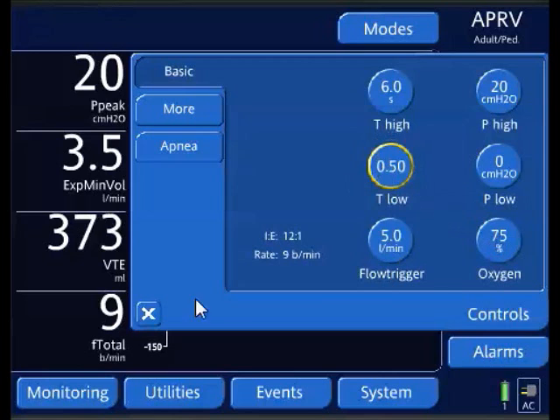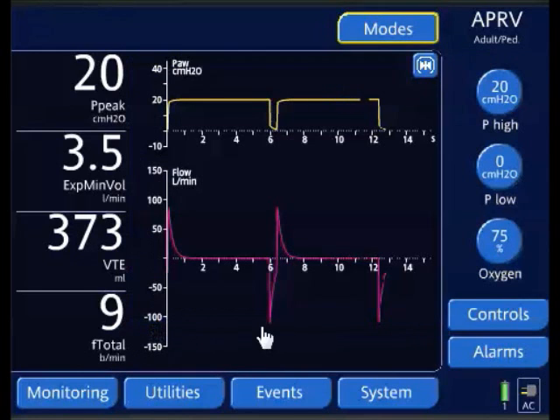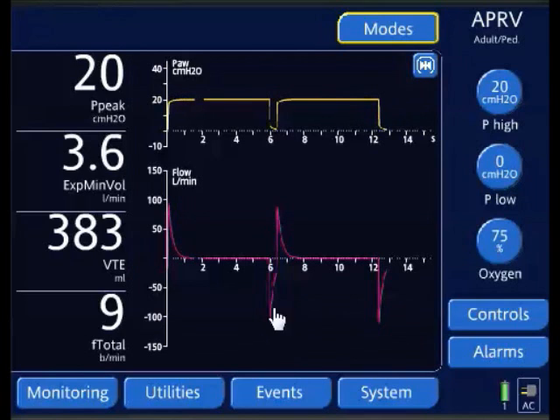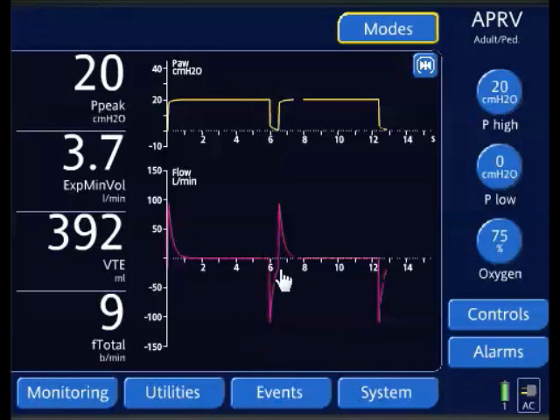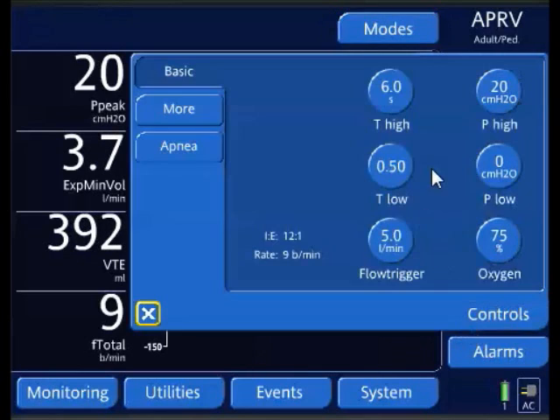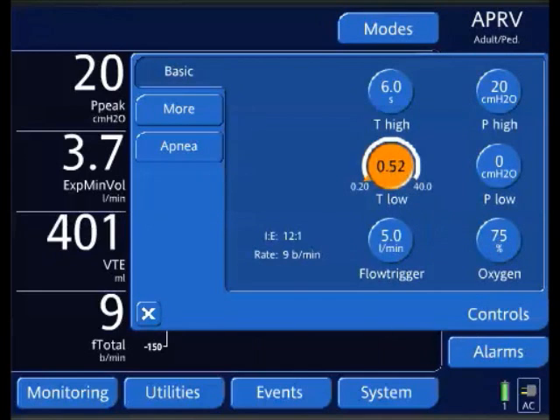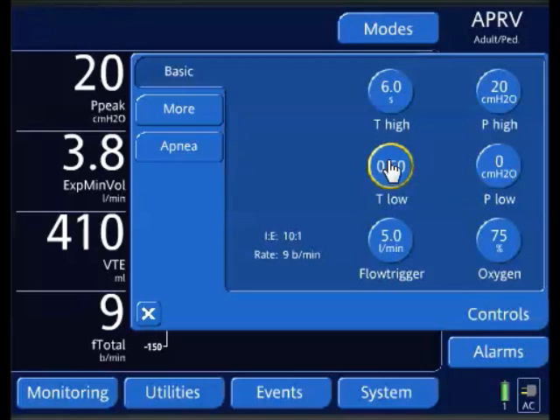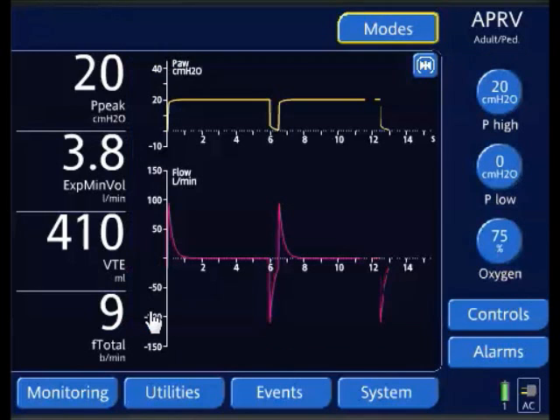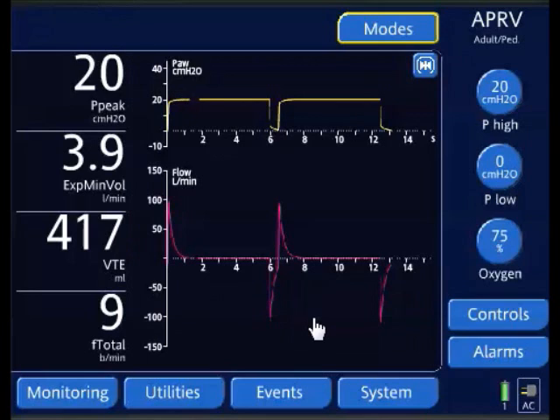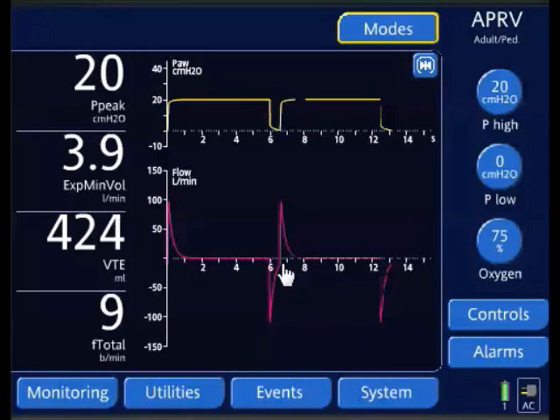I'll reevaluate it after waiting for the new breath to be delivered. It's almost getting there, so I'm going to lengthen it a little more. We're still under the calculated time constant, so we shouldn't see it going back to baseline yet. This is an example of how to do it if you didn't know your expiratory time constant. Now as we look at the expiratory flow waveform, we're almost returning to baseline — we're getting close.